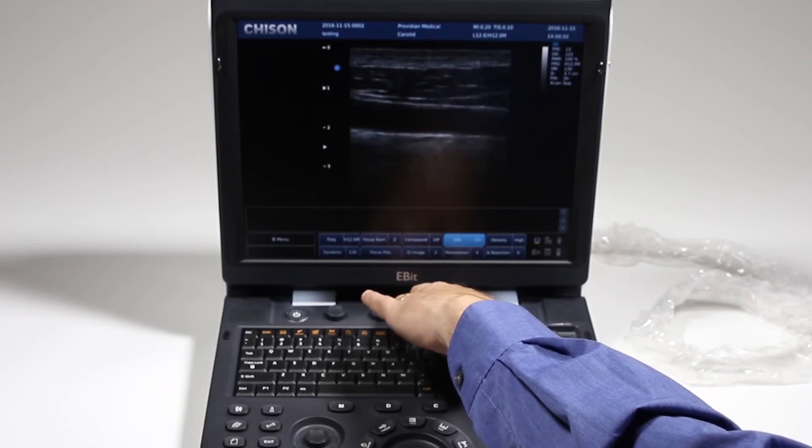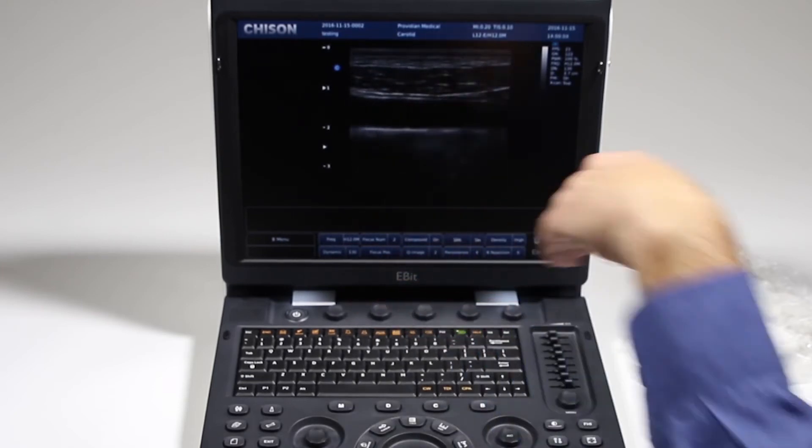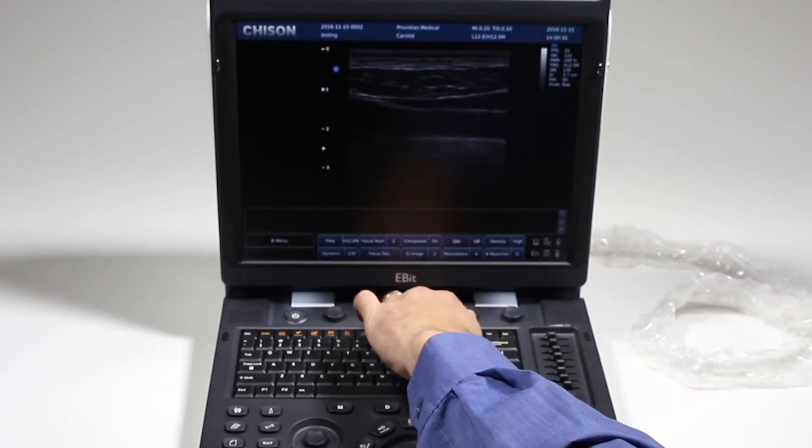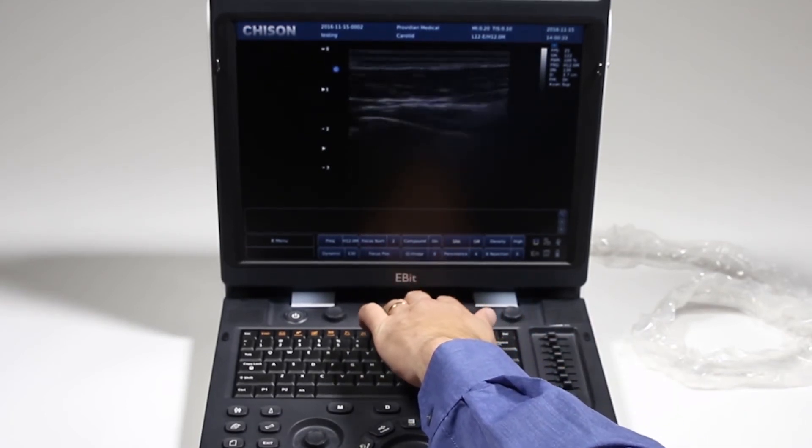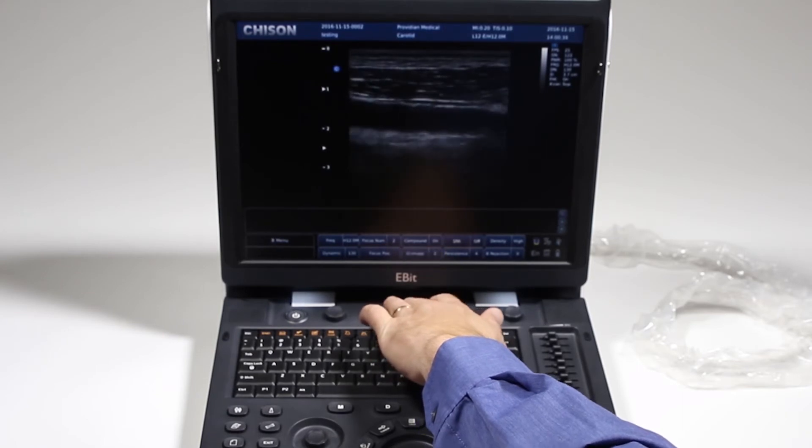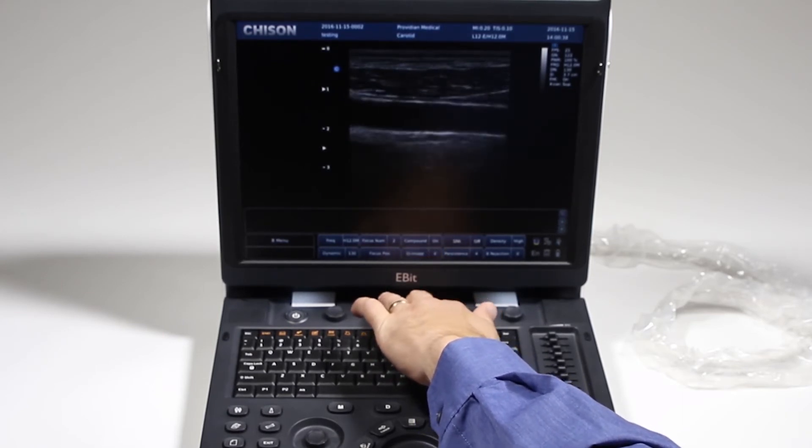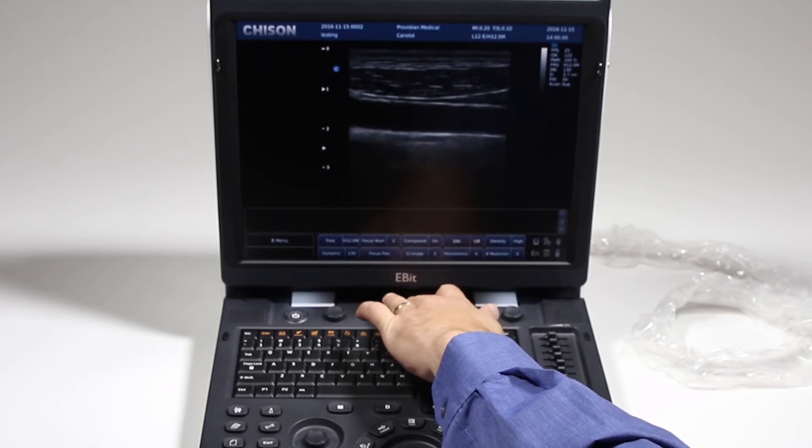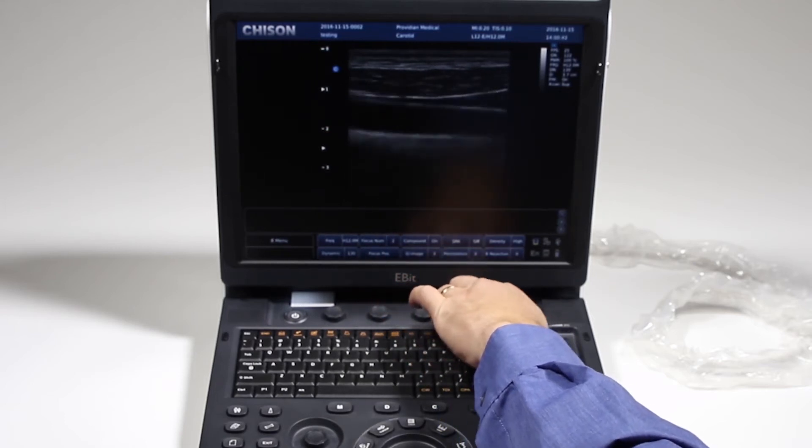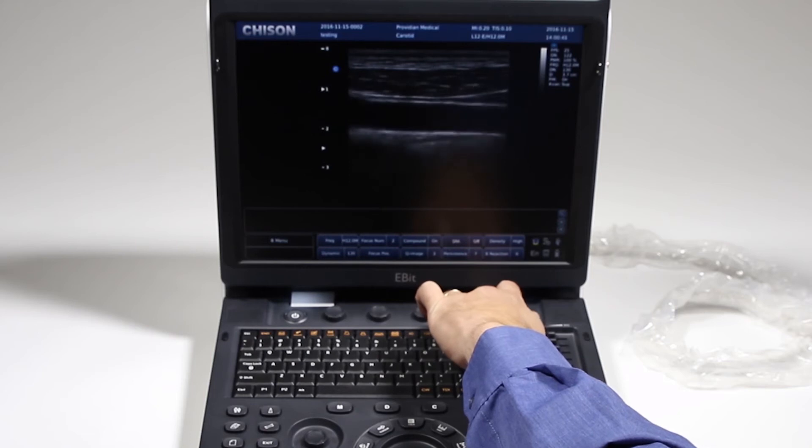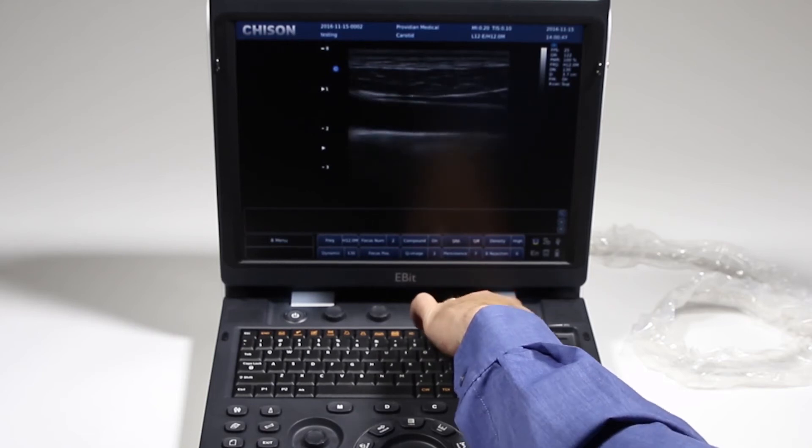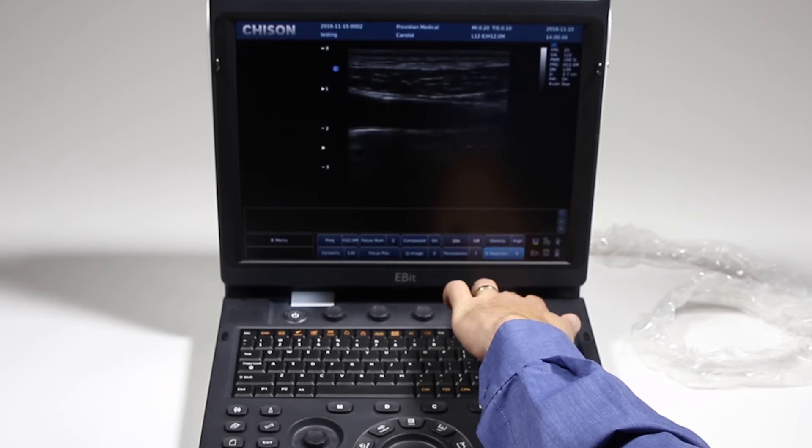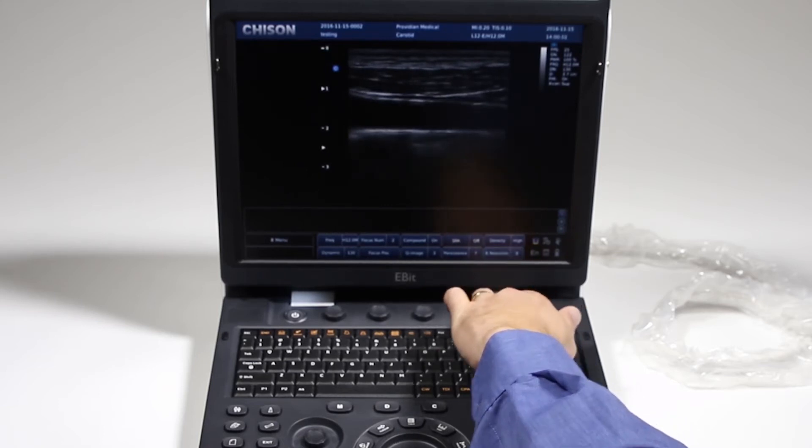Speckle reduction also helps the image as well, cleaning it up. Q image is just yet another way to optimize your image. You can set it at zero or go up and it shows how it can soften or make your image grainier. Persistence is your frame averaging. As you turn it up, it'll make the image look slower, but it also smooths out the image by averaging the frames together. Rejection, just another image optimization.